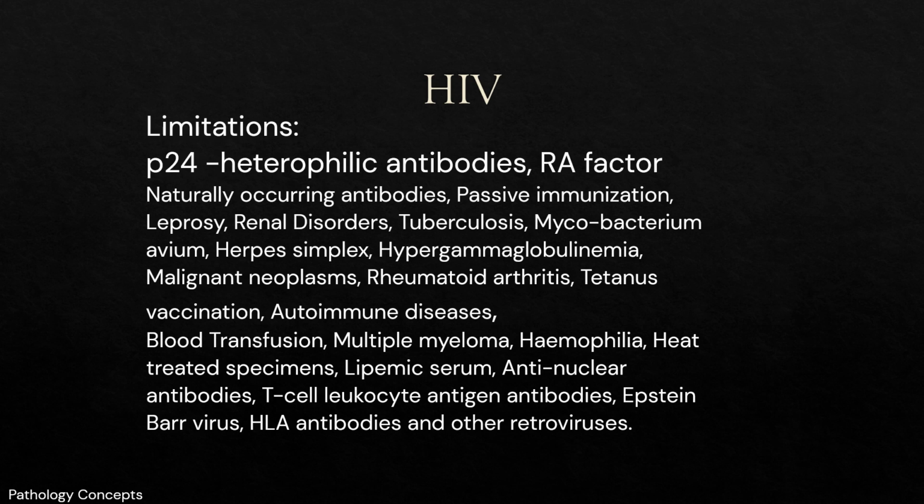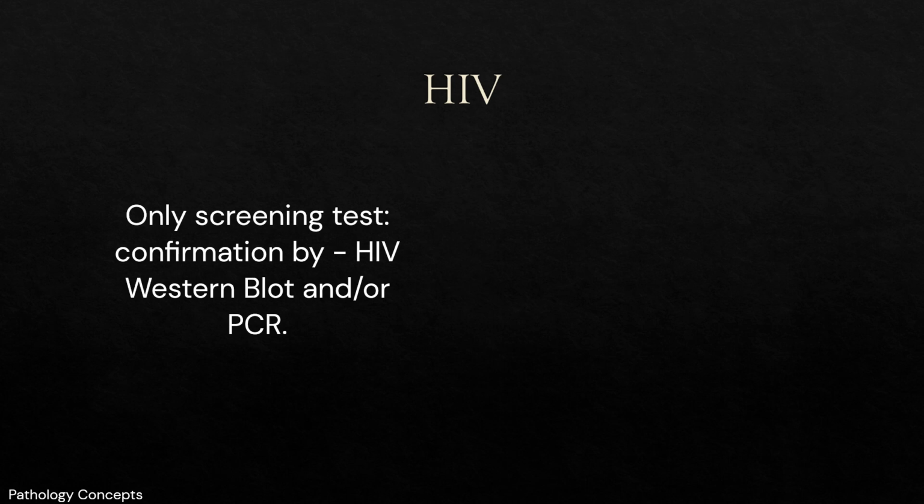hypergammaglobulinemia, malignant neoplasm, rheumatoid arthritis, tetanus vaccination, autoimmune diseases, blood transfusion, multiple myeloma, hemophilia, heat-treated specimens, lipemic serum, anti-nuclear antibodies, T-cell leukocyte antigen antibodies, Epstein-Barr virus, HLA antibodies, and other retroviruses. This is only a screening test, and all samples detected reactive must be confirmed by using HIV Western blot and/or PCR.